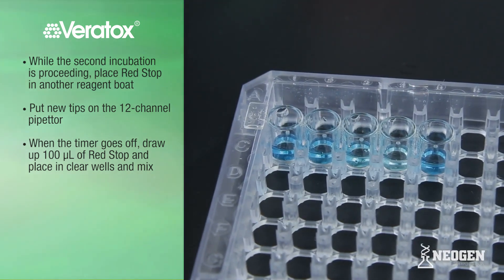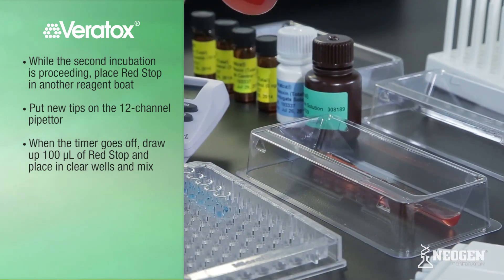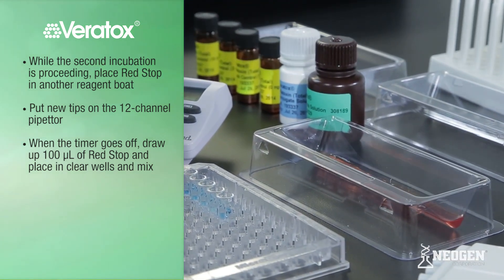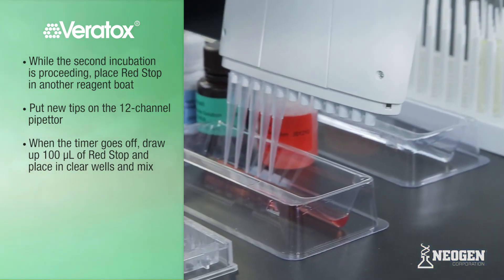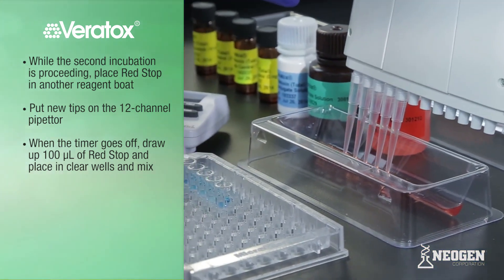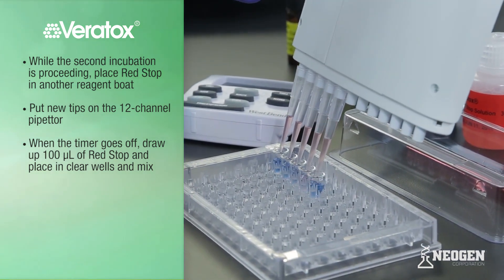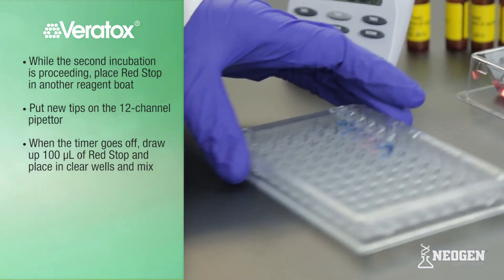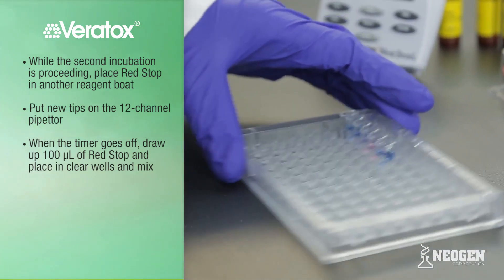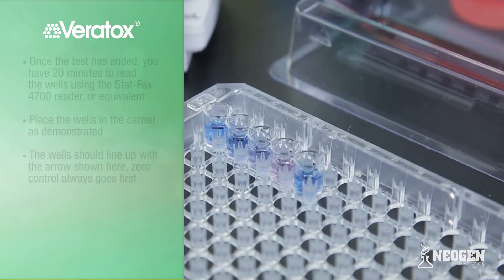The wells should change from clear to shades of blue. While the second incubation is proceeding, place the appropriate amount of Red Stop in a reagent boat and put new tips on the 12-channel pipetter. When the timer goes off, draw up 100 microliters of Red Stop and place in the clear wells. This stops the reaction and ends the test. Mix by sliding back and forth, ensuring that the liquid is homogeneous and there is no layering. Continue to mix if layering occurs.